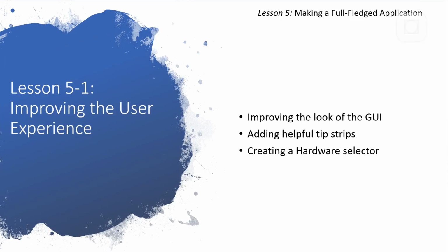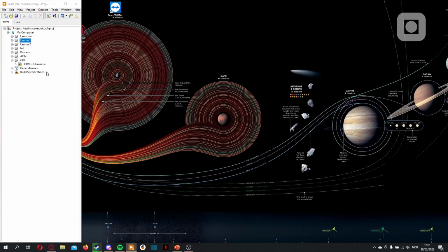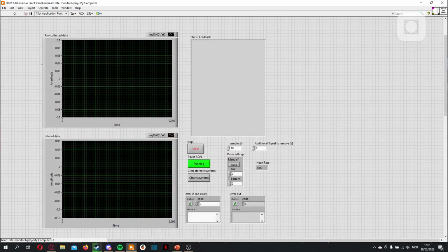We'll be improving the look of the GUI, adding helpful tip strips, which show up when you hover over a button in LabVIEW, which can help the user know what the button actually does. You can't just convey everything with the button label. And then at the end, we'll make a hardware selector pop up so that when you run it, you can select which hardware you have connected, or if you don't have any connected, you can choose the simulator. We can start by opening up the GUI.